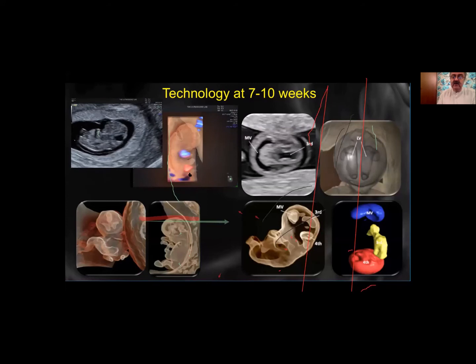So I know I'm looking at a complex anterior abdominal wall defect, an abnormal brain, and perhaps I'm looking at a very early pentalogy of Cantrell, with a little more fullness of the rhombencephalon here. So diagnosis is going back as early as that. We can see ventricular systems by new technology. We can turn a switch and show the ventricular system as early as 9 or 10 weeks of gestation.